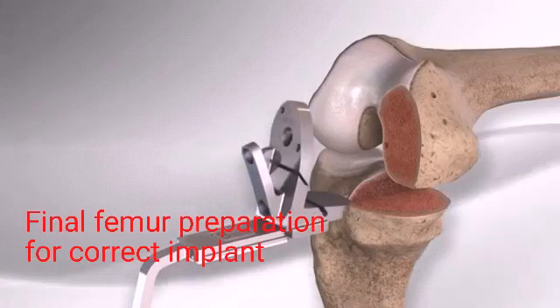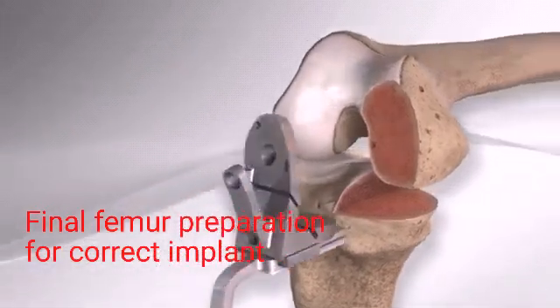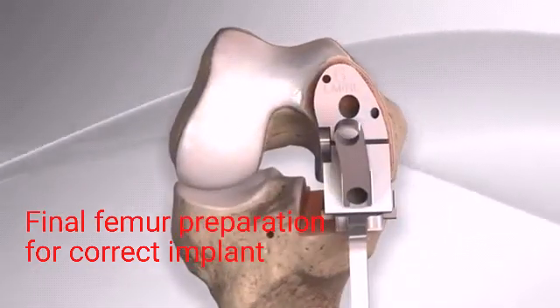Final sizing and preparation of the femur includes drilling holes to accept the pegs of the new femoral resurfacing implant.